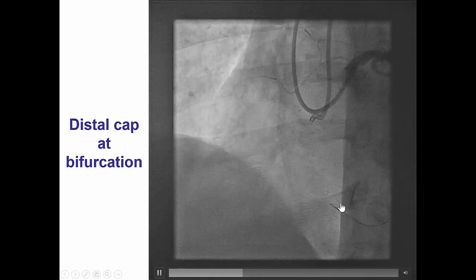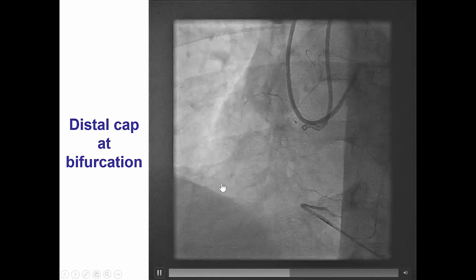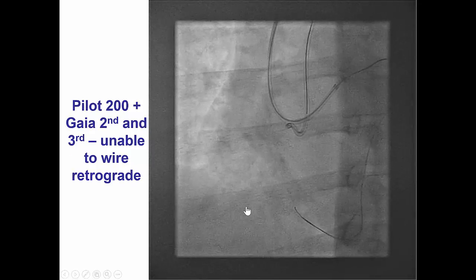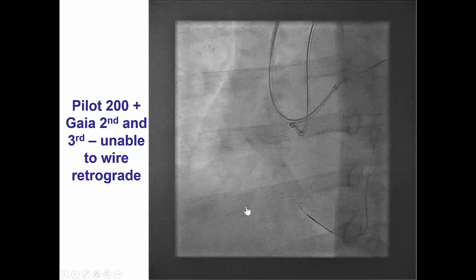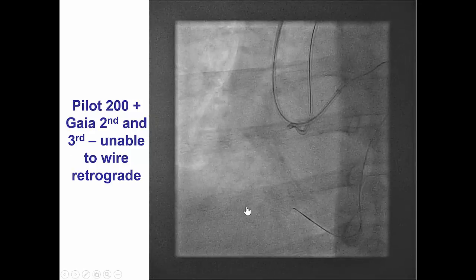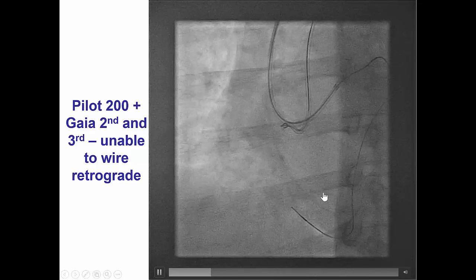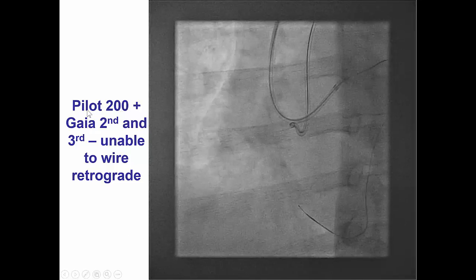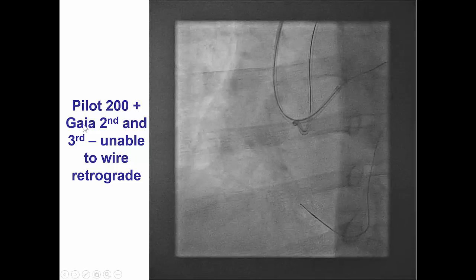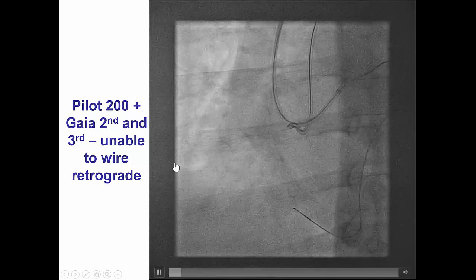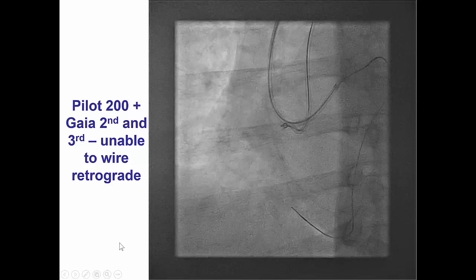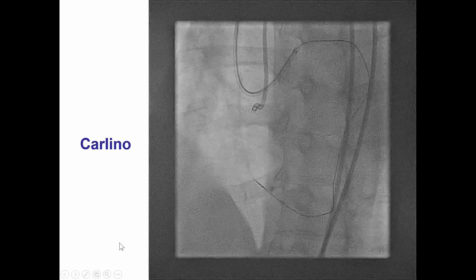There is no stump for the retrograde guidewire to enter, and that was indeed a very challenging area to start advancing retrograde. We used multiple wires — Pilot 200, Gaia 2nd and 3rd — but we could not enter past the bifurcation of the distal cap.